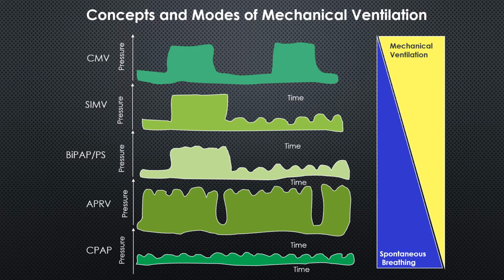And finally, CPAP is the simplest mode of respiratory support for spontaneously breathing patients, where a constant pressure above atmospheric is maintained throughout inspiration and expiration.